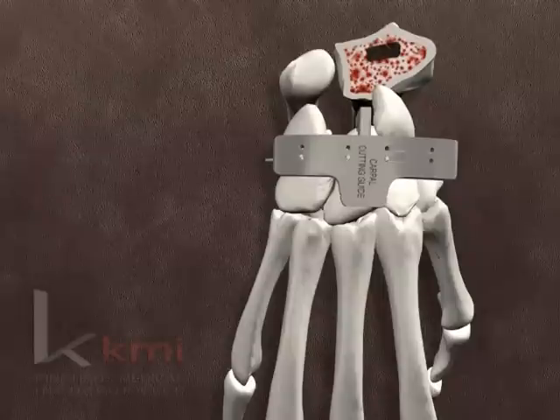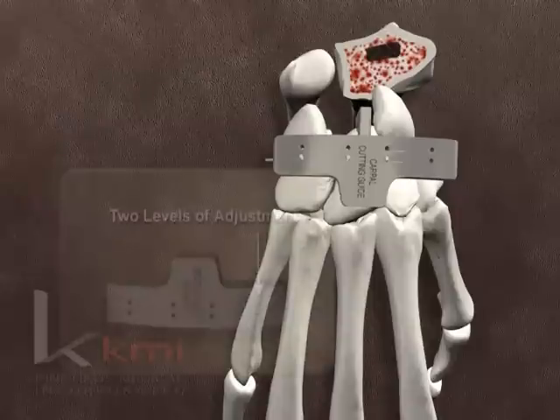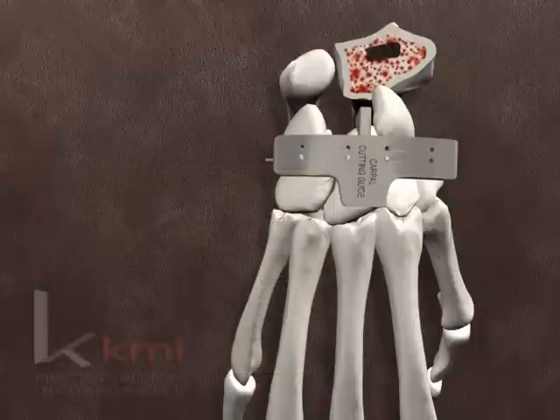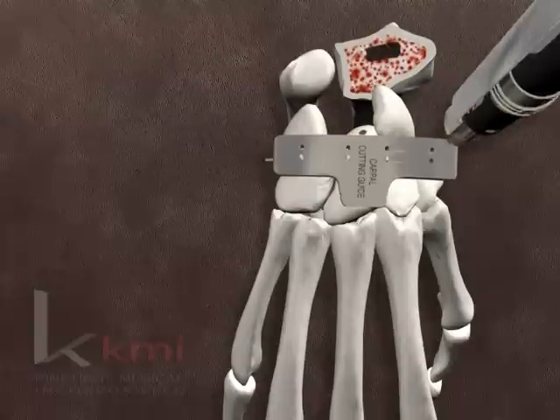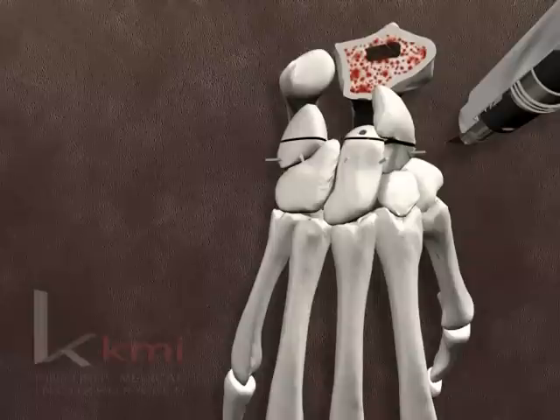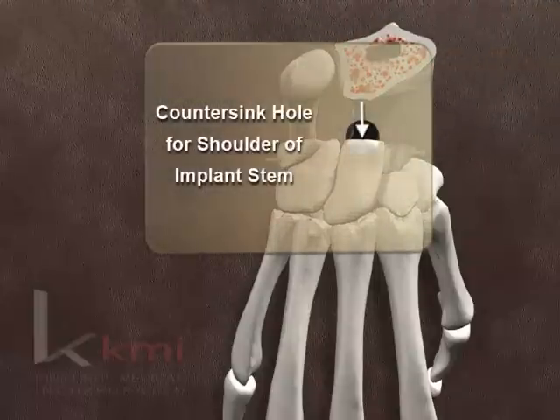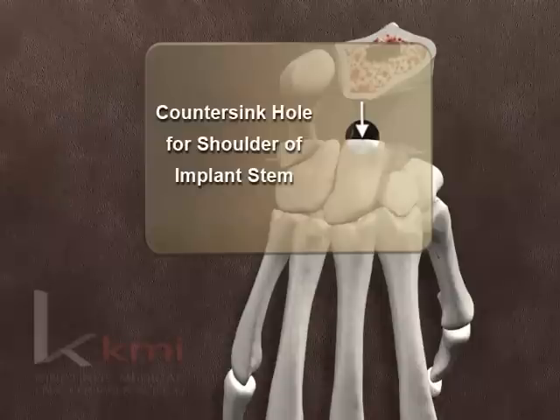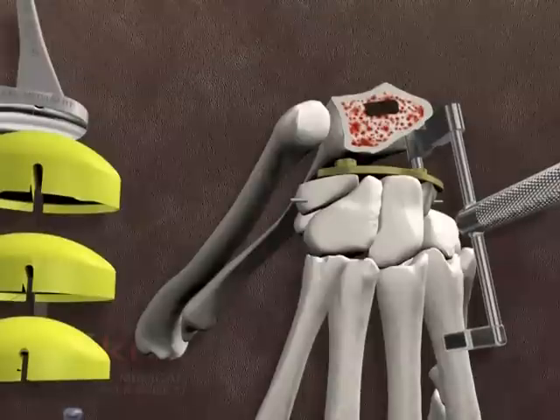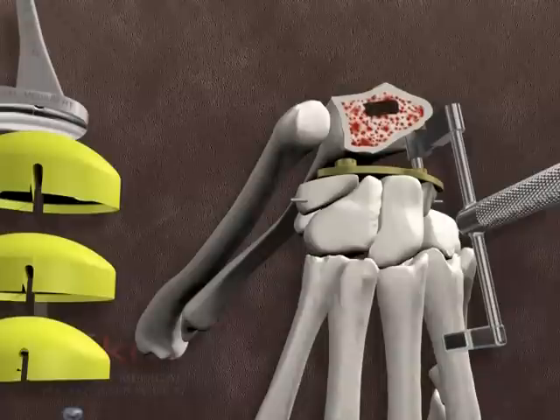While the cutting block is held aligned with the dorsal surface of the carpus, two to four 1.1 mm K-wires are inserted through the holes in the cutting block and drilled into the carpus. The K-wires are cut a few millimeters above the cutting block. The position of the cutting block is checked for proper level of resection and to confirm the cut will be made generally perpendicular to the third metacarpal shaft. A small oscillating saw is used to make the carpal osteotomy. To complete the cut through the volar cortices, the cutting block may have to be removed, but the K-wire should be retained. Once the osteotomy is completed, the countersink is used to enlarge the opening of the hole to accommodate the shoulder of the implant stem. A trial carpal component is inserted into the capitate hole and its dorsal edge is aligned with the dorsal surface of the carpus.